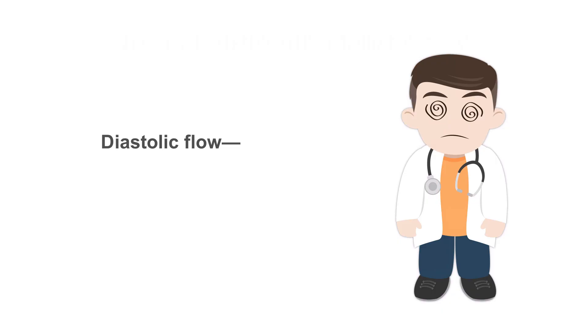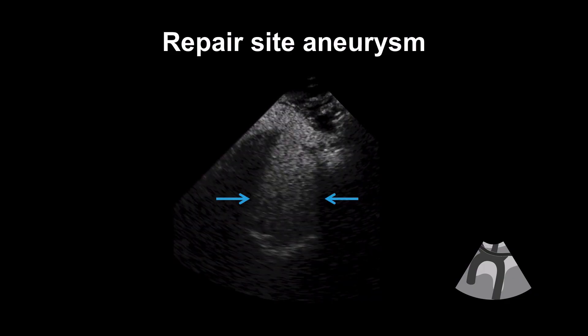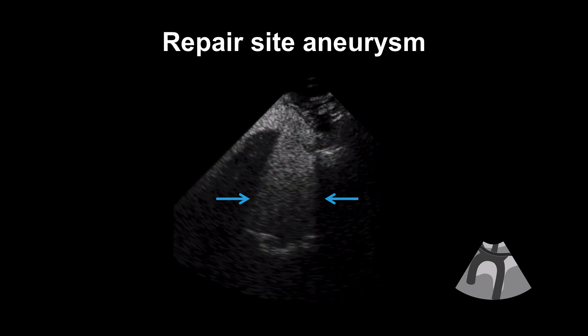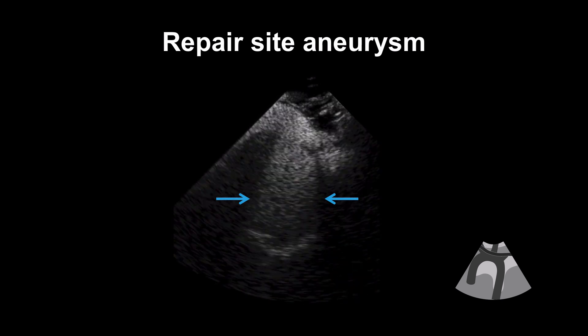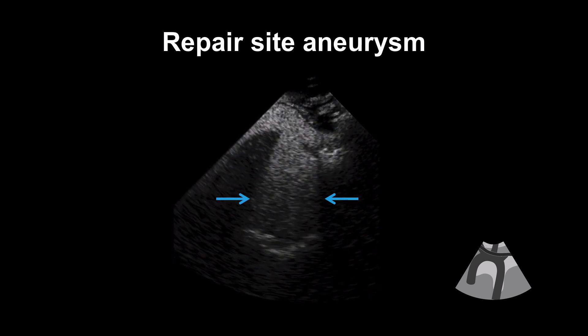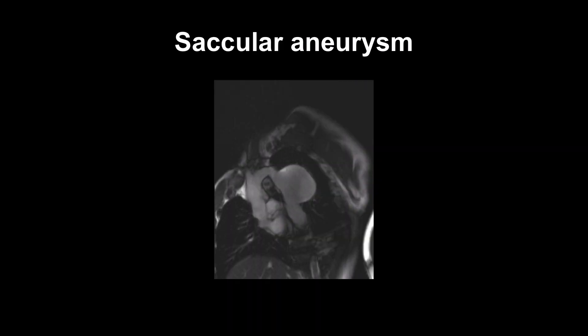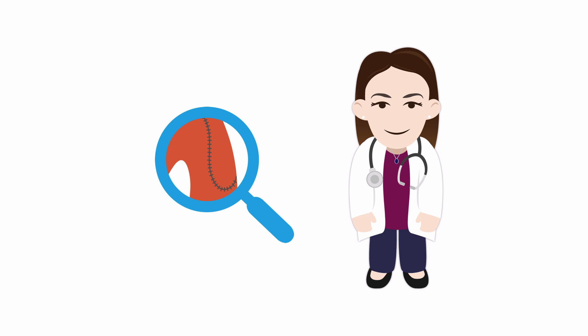So what could be causing diastolic flow in the aortic arch but not in the abdominal aorta? This might explain it: the aortic arch enhanced with ultrasound contrast shows a huge aneurysm at the repair site, and MRI shows it beautifully. The diastolic flow on the Doppler trace was blood swirling around within the saccular aneurysm. Coarctations can be repaired but shouldn't be forgotten — the various types of repairs work really well in the majority of patients, but the complications are well described.